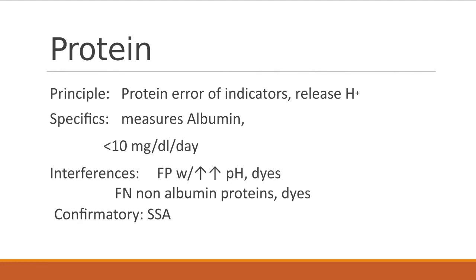Mostly when you have it, you can get a protein clot, but whenever you heat it up, whenever your urine is heated, then it'll still remain. So sometimes you can do things temperature-wise for testing, and it causes some type of a difference between them, and you'll see that in some other classes too. And you can identify proteins through electrophoresis and immunoelectrophoresis. So that also could show up with this Bence-Jones protein.